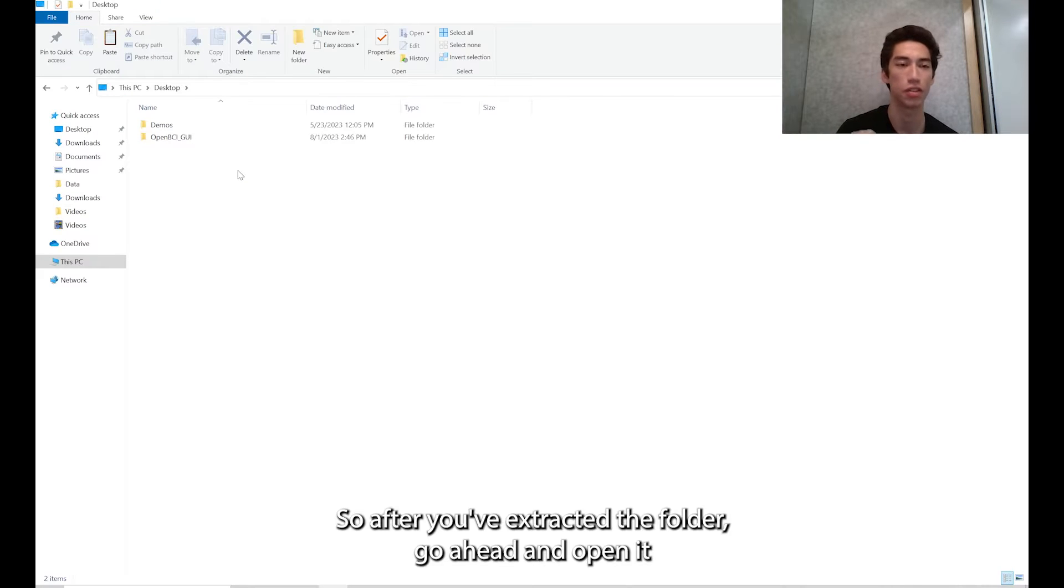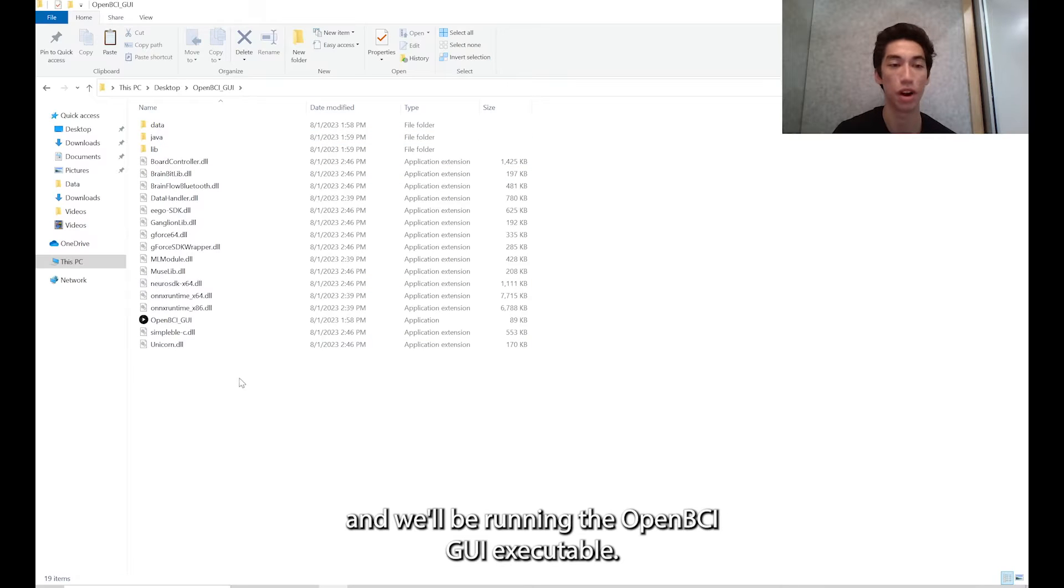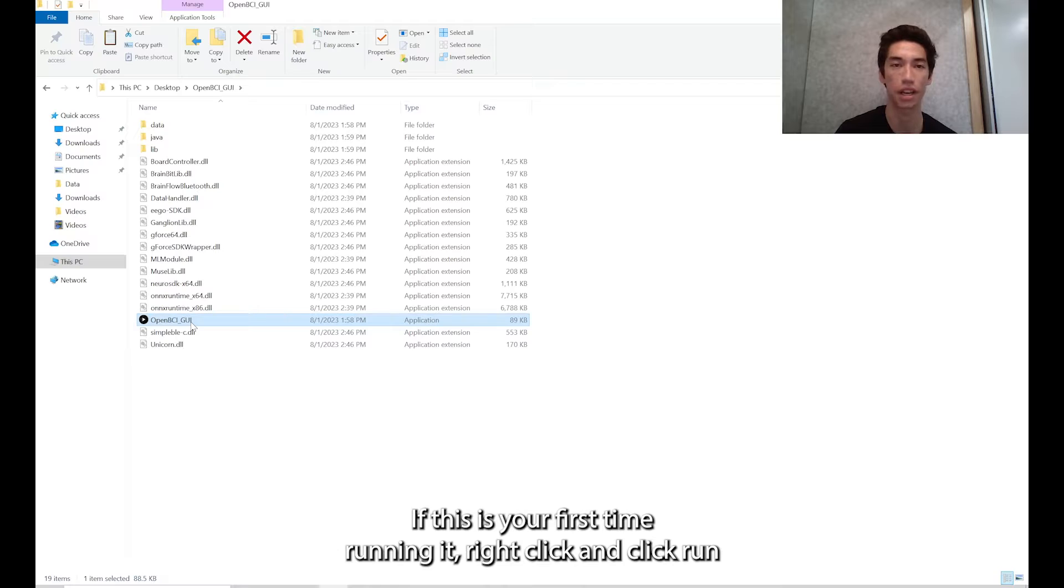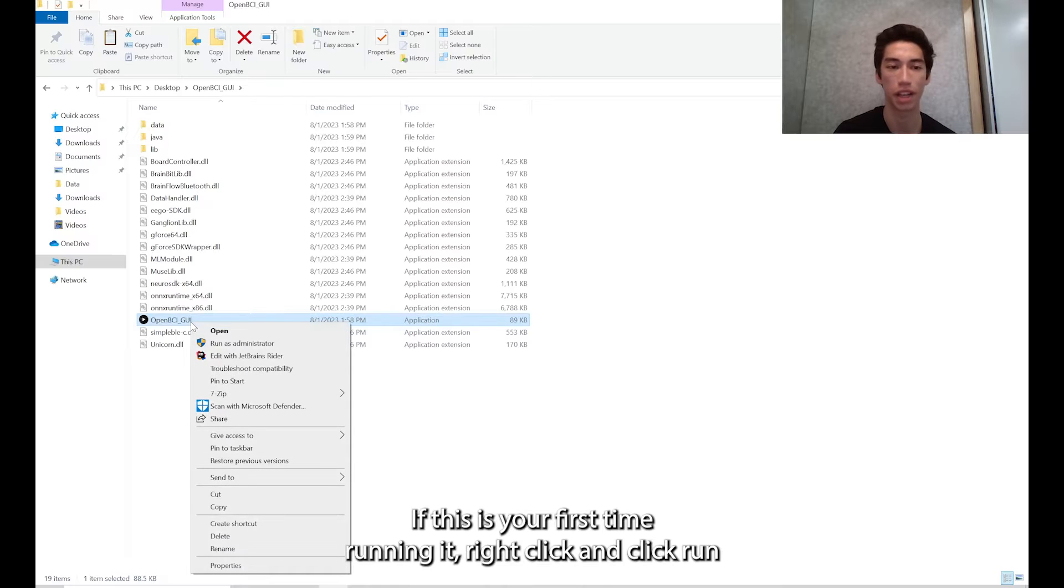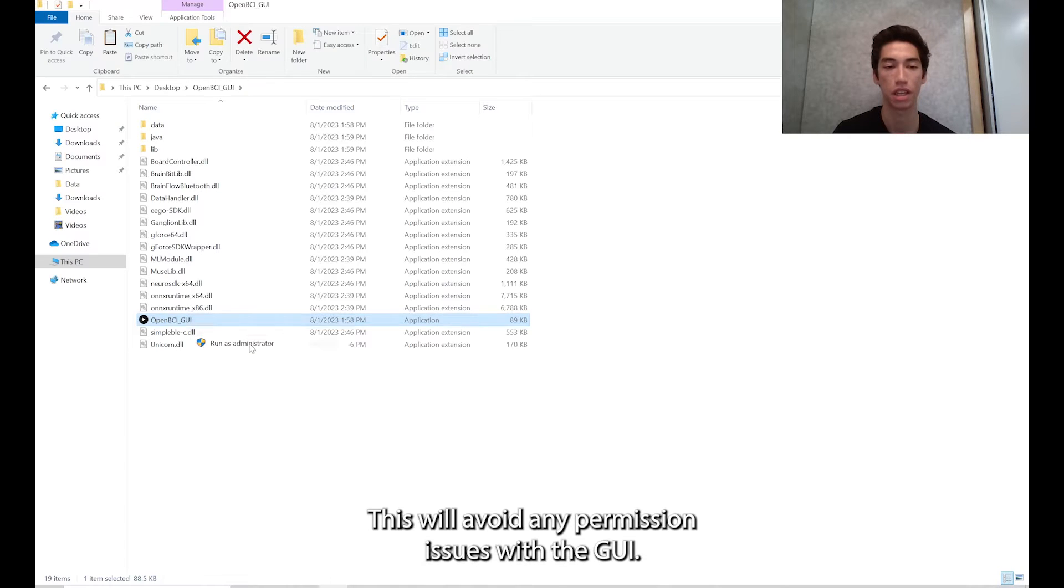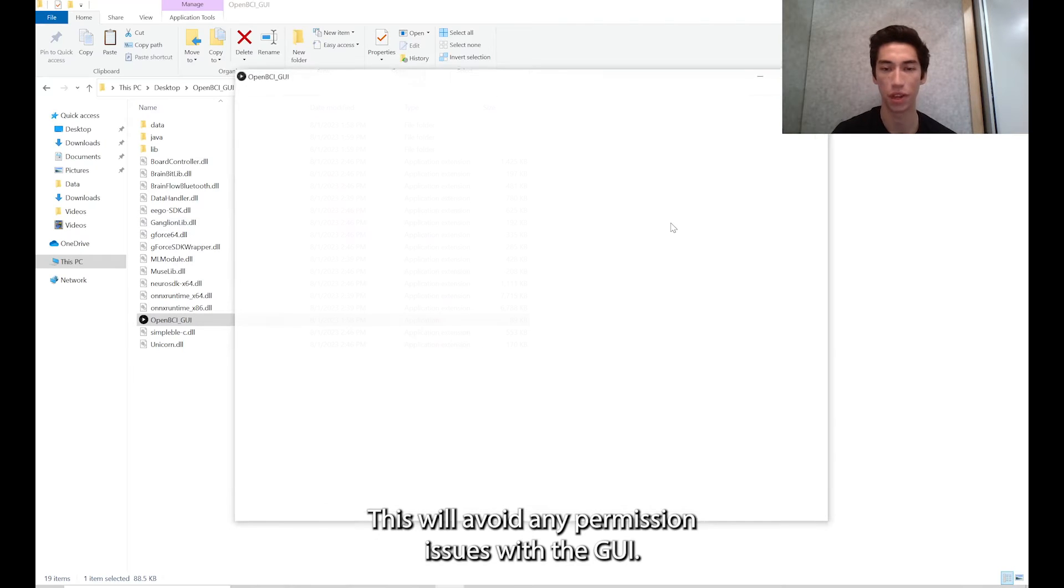After you've extracted the folder, go ahead and open it and we'll be running the OpenBCI GUI executable. If this is your first time running it, right click and click run as administrator. This will avoid any permission issues with the GUI.